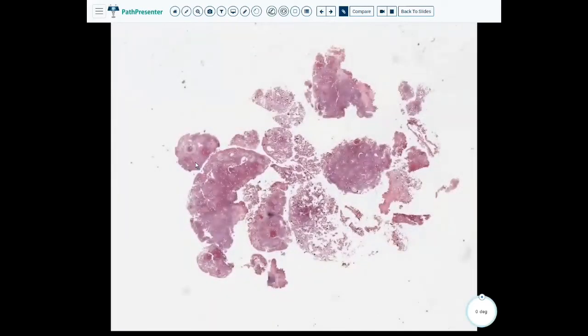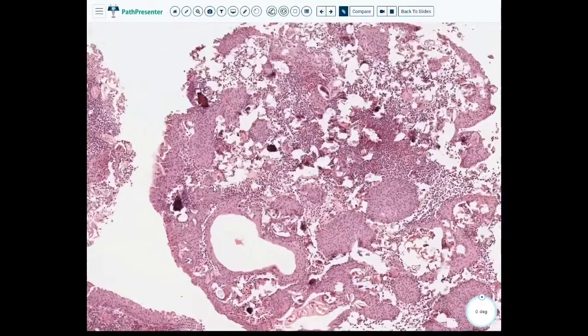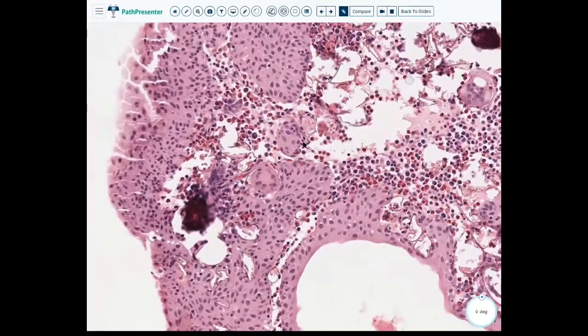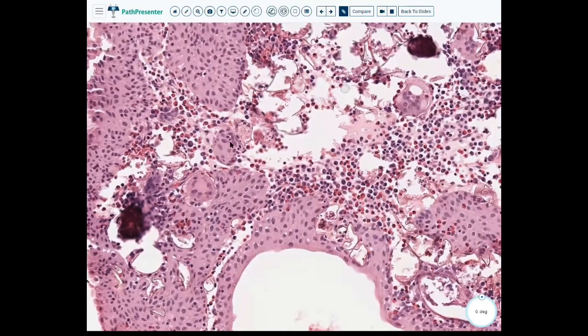Case 2, it doesn't actually look like maybe we have any urothelium here. Don't see any blue. It all looks really pink. So let's just go down. Okay. So what we see here is we have urothelium, lots and lots of eosinophils. Remember, eosinophils have really pink-red granules and that bilobed nucleus that kind of looks like headphones, or like the granularity almost gives it like a disco ball type appearance, but they're extremely red. And lots and lots of eosinophils.